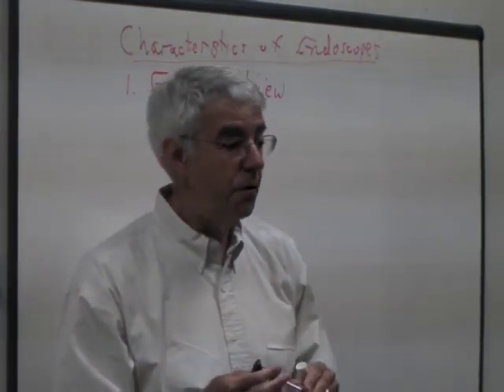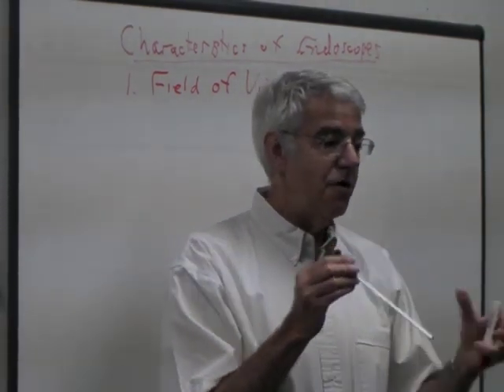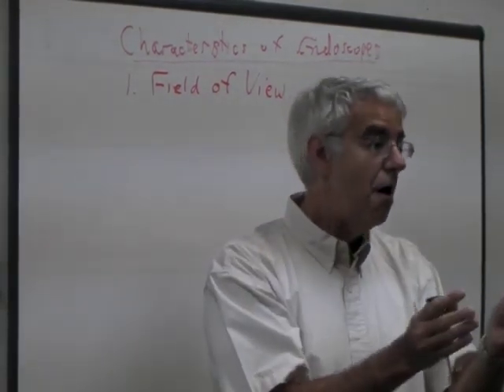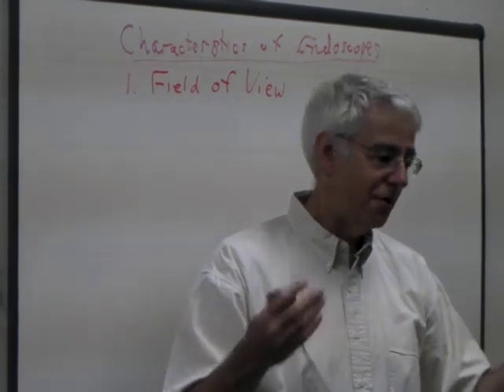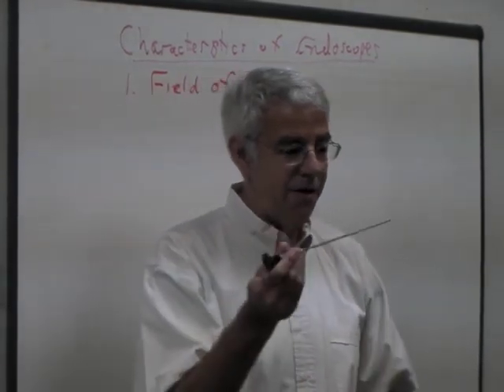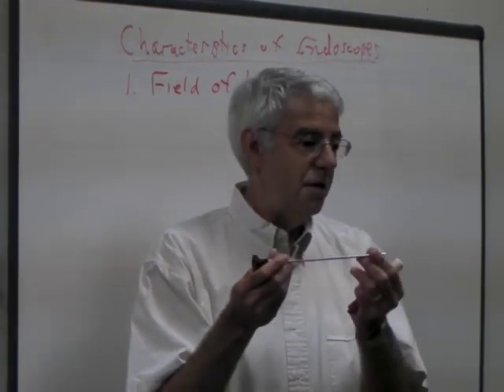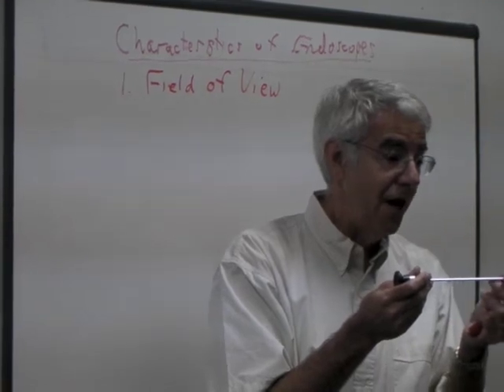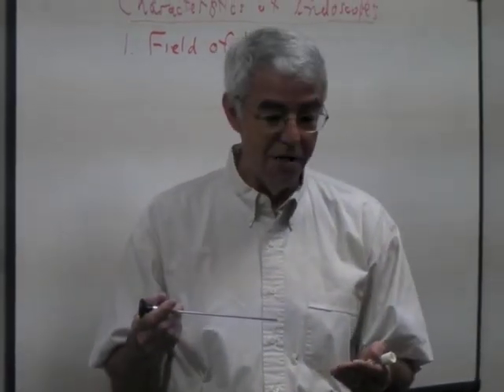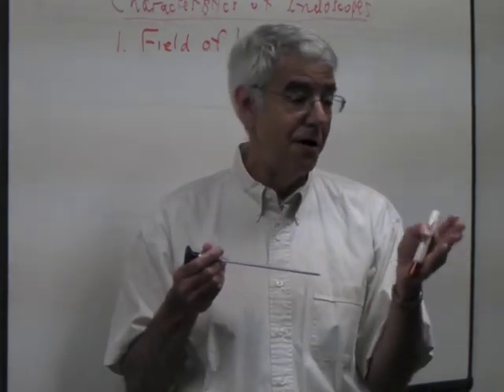Another way to think about field of view is magnification. If we had a small field of view in this instrument, everything would look bigger because we'd be filling the image on the monitor with a smaller part of the anatomy, so it's going to be magnified more. So if a surgeon all of a sudden had a 70 degree field of view with an instrument like this, they would think maybe that the scope was too close to what they were looking at, or even worse, there's something wrong with the patient's anatomy if they knew, no, I'm definitely the right distance away, and that liver is way too big. We got a problem.